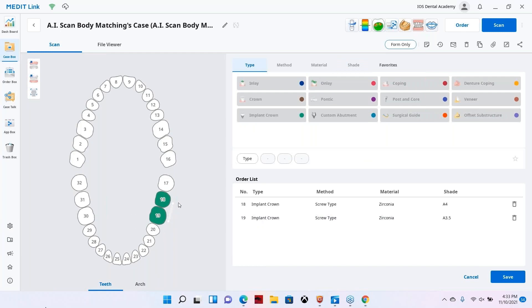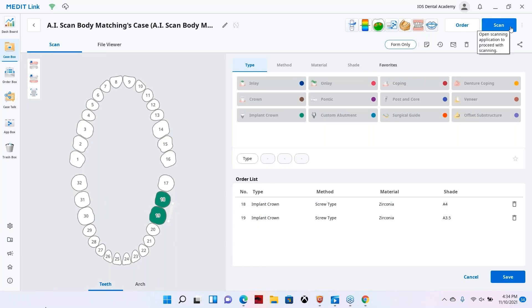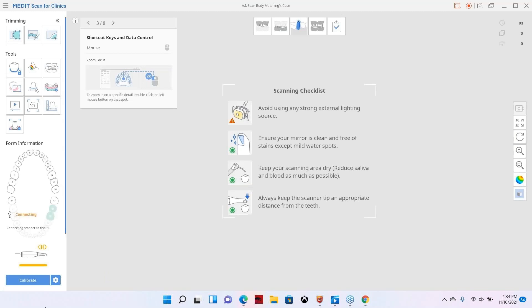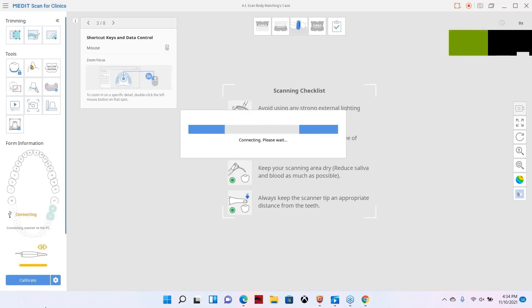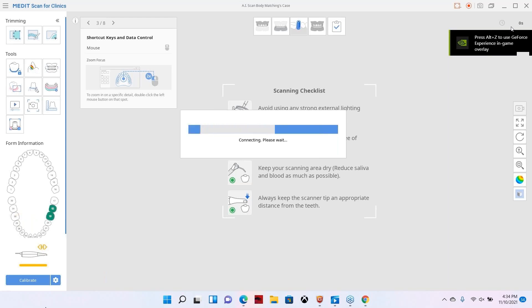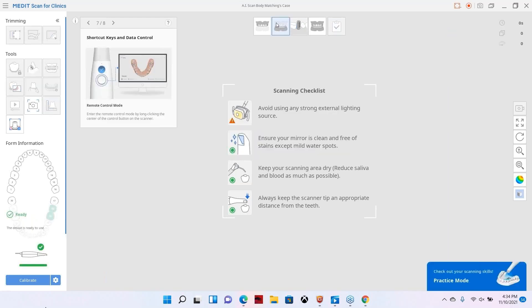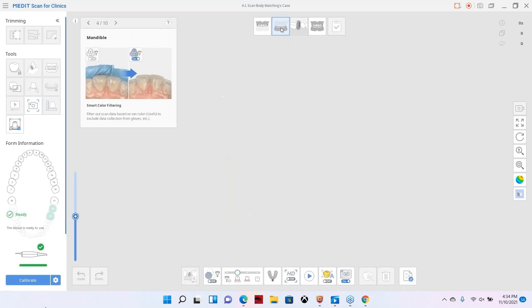You can select these teeth together by pressing control. As you select the teeth, you'll end up with the same shade and you can just go back in and change the shade as need be. Once you've selected your RX form here, you can go up to the upper right hand corner and press scan. We're going to open medit scan for clinics. As always, when we do these webinars, I like to keep them as short as possible and just address the topic at hand.